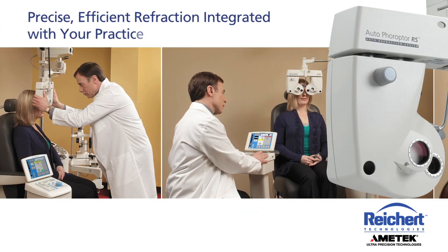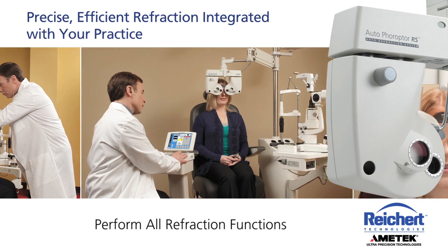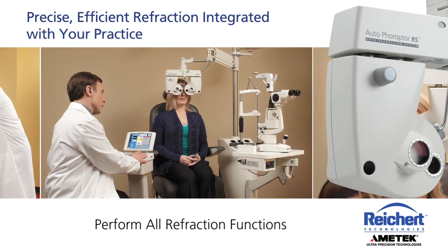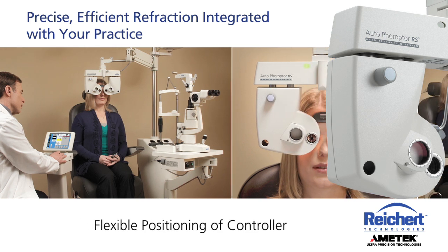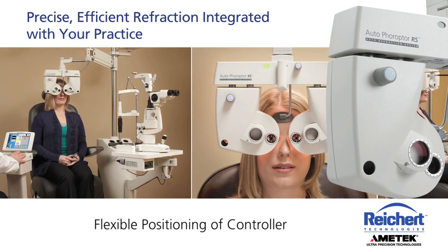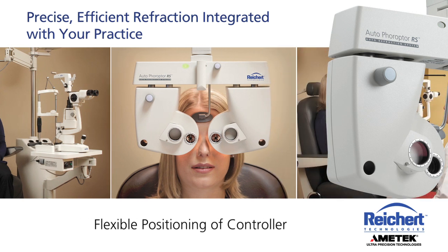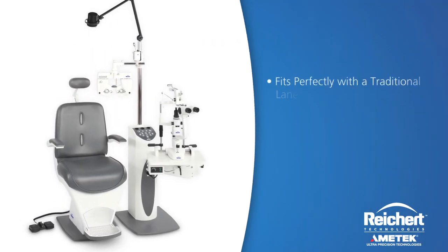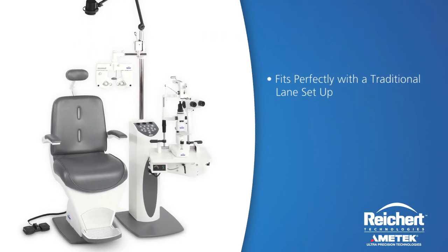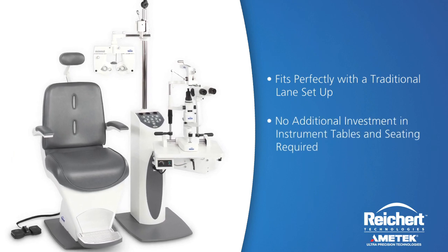The Auto Phoropter RS easily adapts to your practice, allowing you to perform all the functions of manual refraction while comfortably sitting next to your patient. The controller is small enough to place on any work surface. A small mobile table is available to position the controller anywhere in your lane. The system configuration fits perfectly with a traditional lane setup and requires no additional investment in instrument tables and seating.